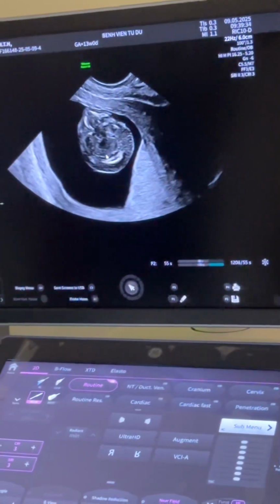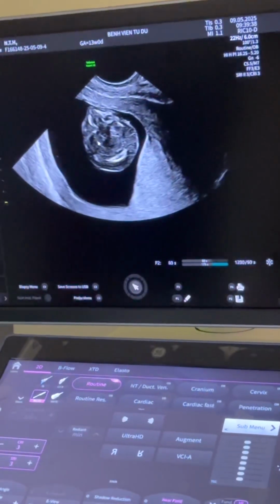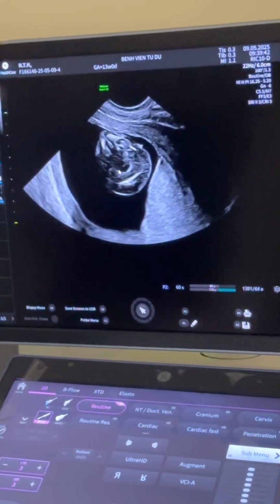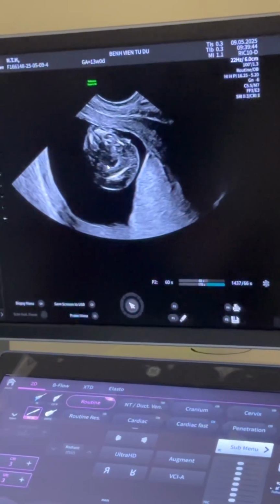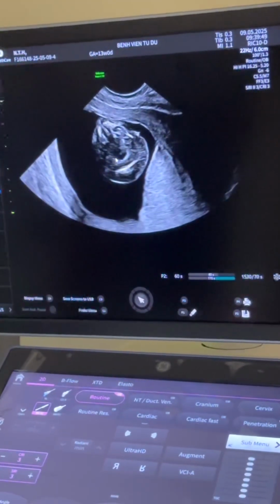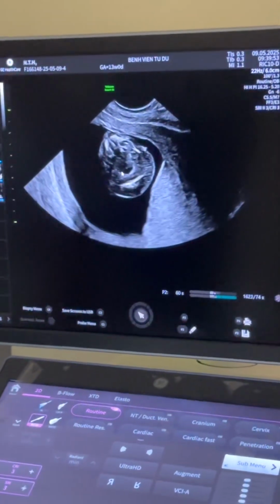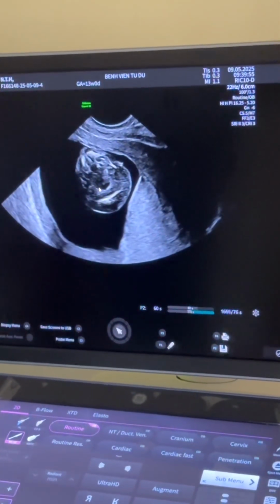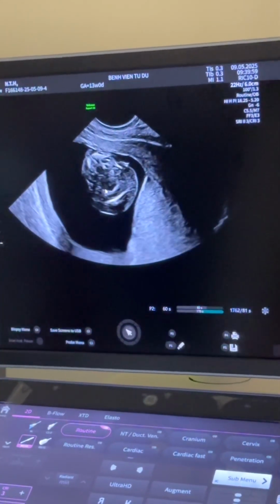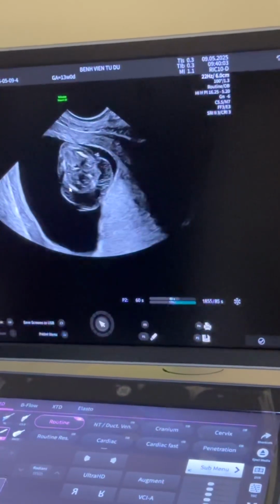So now if I look at that fourth ventricle, I think that is the dilated fourth ventricle, but I want to get more images. As soon as I see the fourth ventricle is dilated and I see a cardiac abnormality with an increased nuchal translucency, I think of number one, digynic triploidy. 90% of babies with digynic triploidy will have a dilated fourth ventricle. Now it tends to be a much larger fourth ventricle. If you look at trisomy 13, about 70 to 80%, trisomy 18, about 50%, and then Down syndrome. So the cerebral fourth ventricle is a very powerful marker.